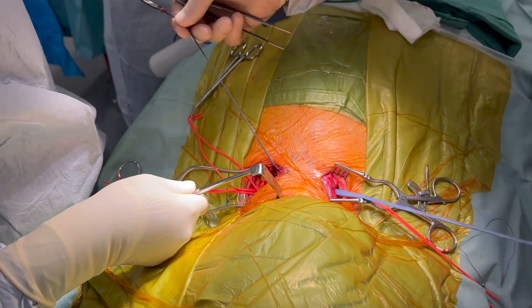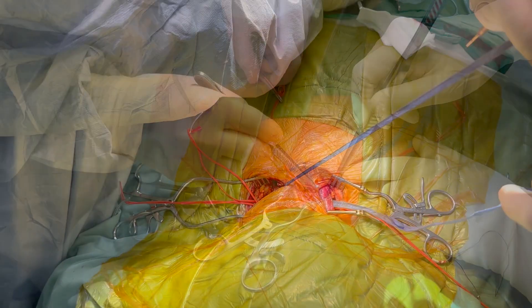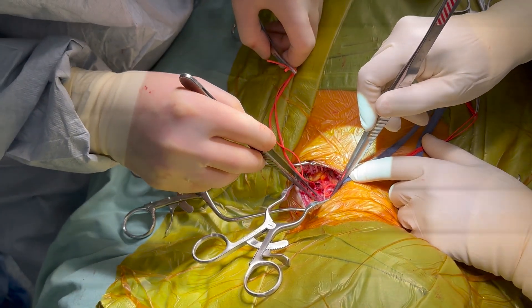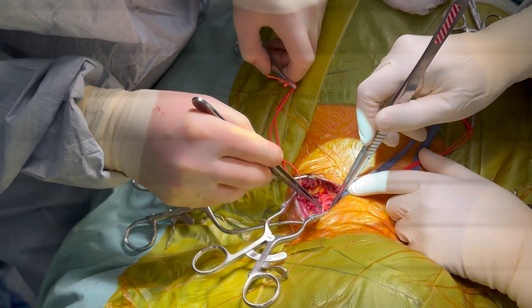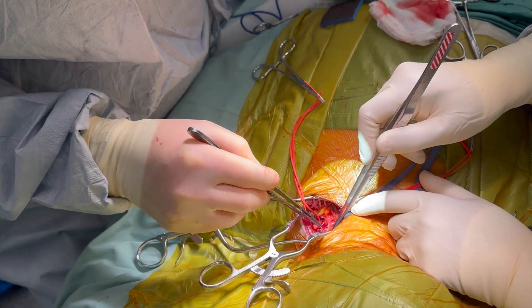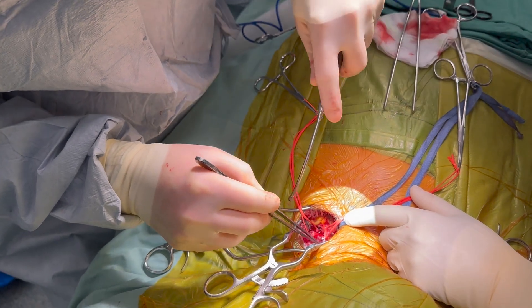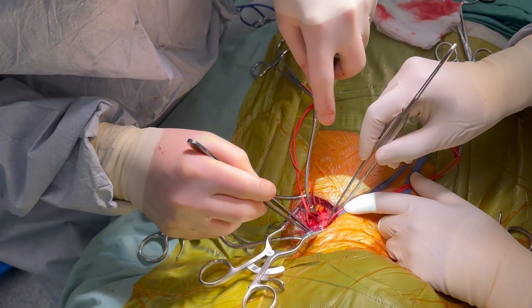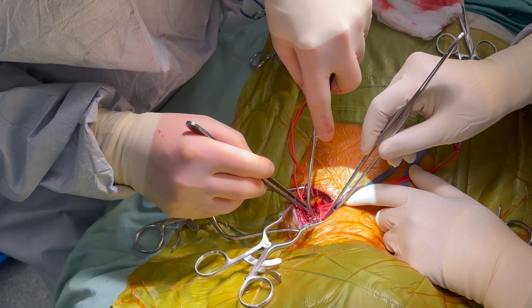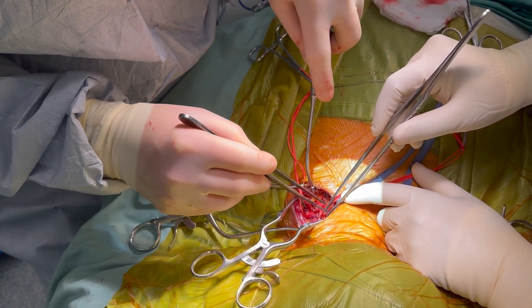We now have the tunnel. Heparin can be given now — 5,000 units. The scalenus anterior was here, and I've divided it to expose the subclavian artery. Before doing that, we had to find the phrenic nerve, which usually runs on the front of scalenus anterior from left to right — and you can see the phrenic nerve here, which we've slung.